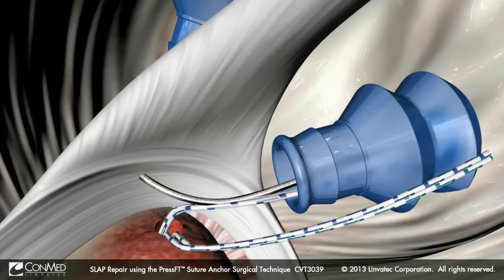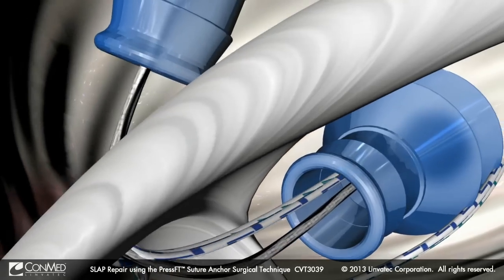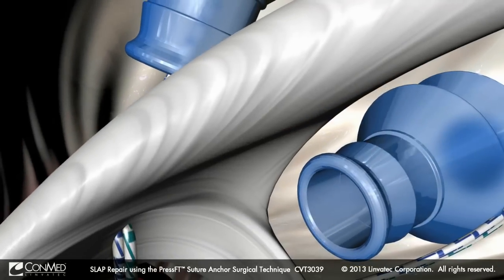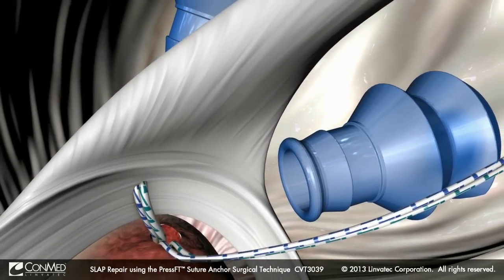Use a spectrum crescent hook and super shuttle relay to pass two suture limbs from the anterior mid-glenoid cannula through the labrum directly behind the center of the two biceps tendon attachments and out the anterior superior portal.